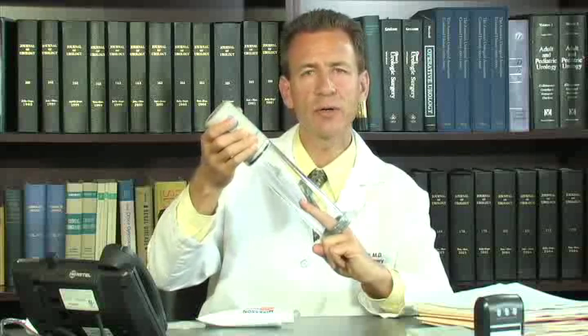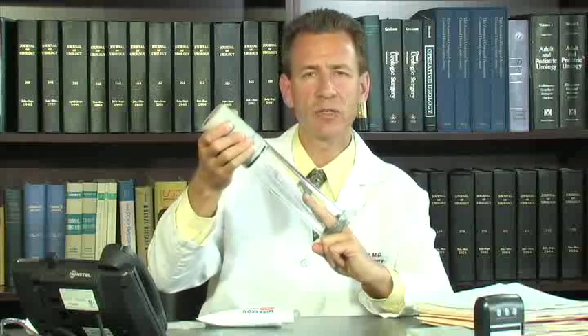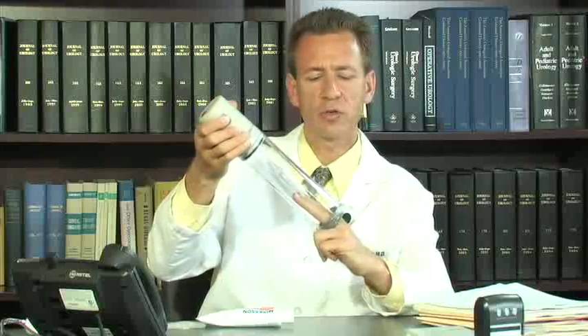This process is continued until the penis is fully erect. Once the penis is fully erect, the constriction ring is released, trapping the penis in an erect state and keeping the blood within the chambers of the penis.